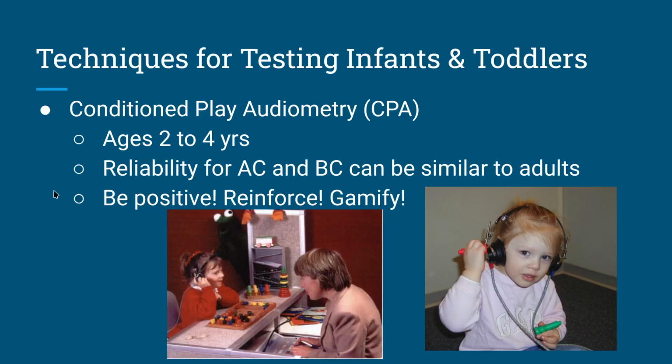Don't let them do the task when the tone is not presented. In some cases, use an up 10, down 20 method to quickly bracket. Target one low frequency like 500 Hz and one high frequency like 2000 Hz per ear. Sometimes an appointment will take 2 visits for pediatrics.